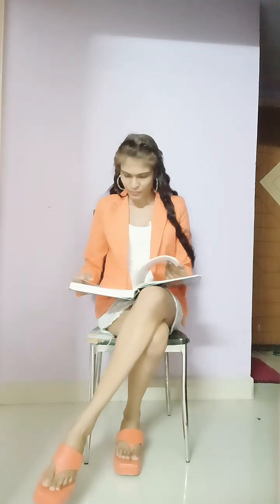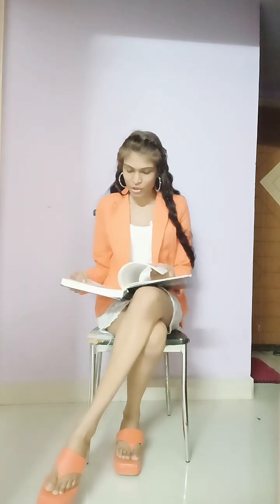Hello everyone, in this video I'm going to talk about goniotomy. I wanted to include this topic under laser procedures, thinking goniotomy was laser also, but laser goniotomy has a different name. It is called trabecular puncture, or laser trabeculotomy.